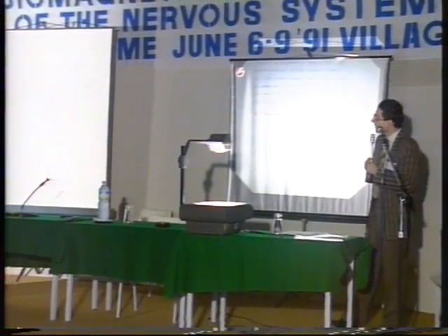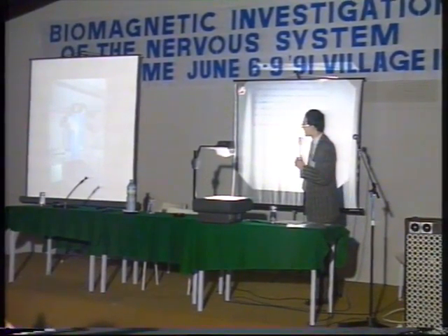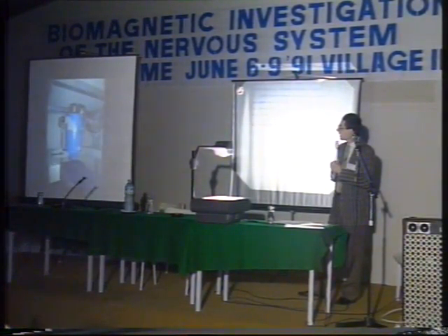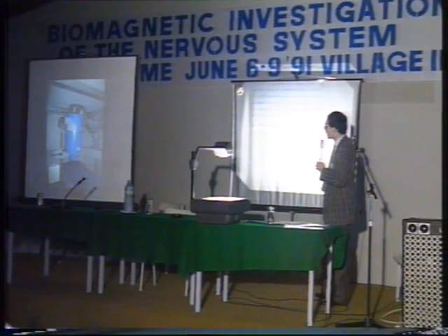It's working very fine. This system was originally designed to work outside a shielded room, so now that we have this opportunity to have the system inside, we are absolutely clear, with no problem for artifacts or 50 Hertz signals.